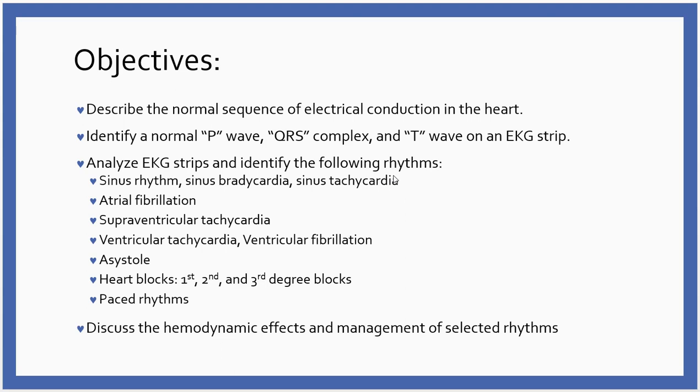Now, the other piece of it that's very important is we're going to be discussing the hemodynamic effects and management of selected rhythms, because it's not enough to look up at the monitor and say, oh, gee, I have a patient that's in supraventricular tachycardia. I've got to know what I'm going to do after that. And so we'll be going over that too.